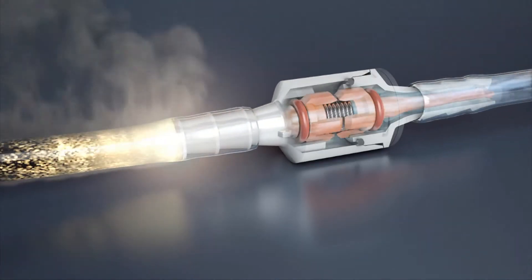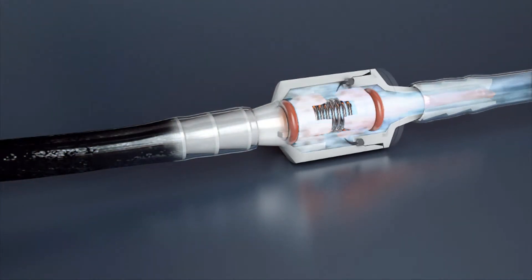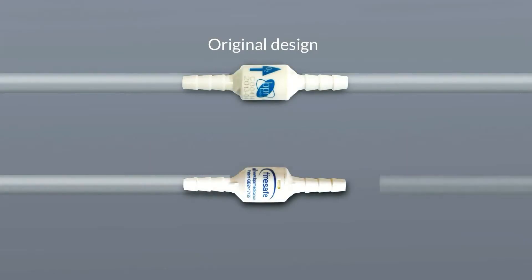Original fire brakes must be installed in the correct orientation. An arrow indicates the direction of oxygen flow. The new fire brake design is bi-directional, comprising two valves, and can be installed either way around.